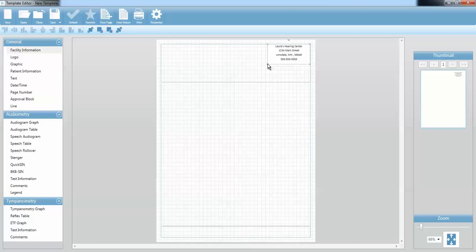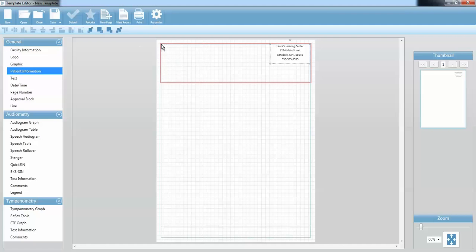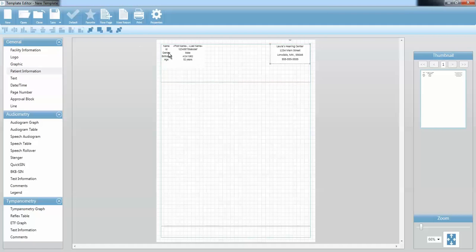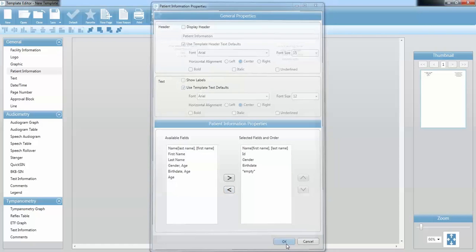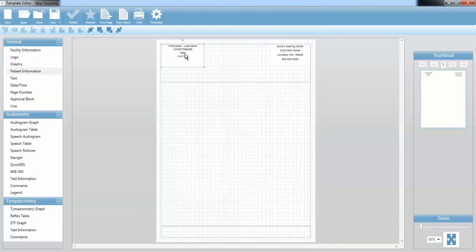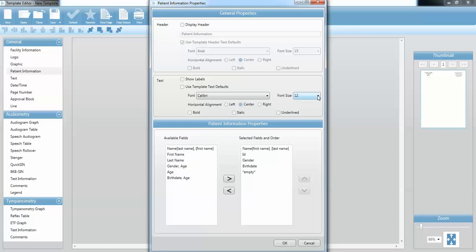You can resize any of these components just like a picture in a word program — click on one of those corners until you get the arrows and resize as needed. The next thing I'm going to pull over is my patient information, so I'm going to click on that and drag it over to my report. I need to adjust those general properties, so I'll double-click to open General Properties. I'm going to uncheck Show Labels. I do want to keep the name, the ID number, and the gender. I don't need the age, so I'm going to take that out and press OK.